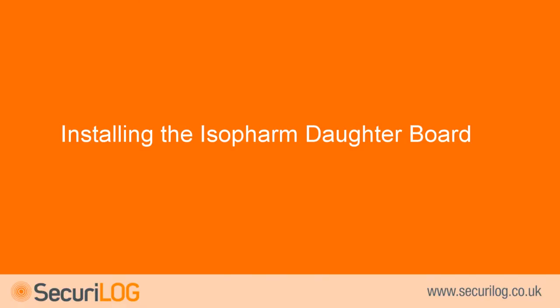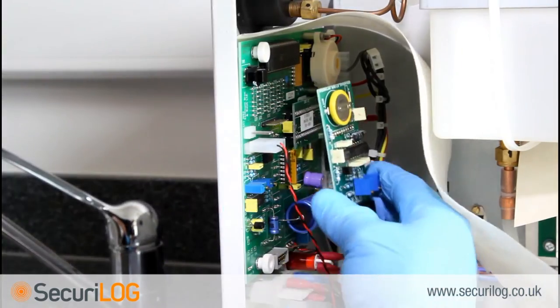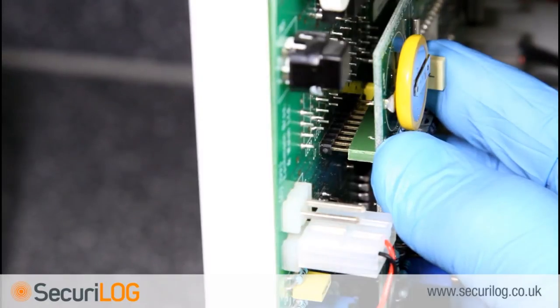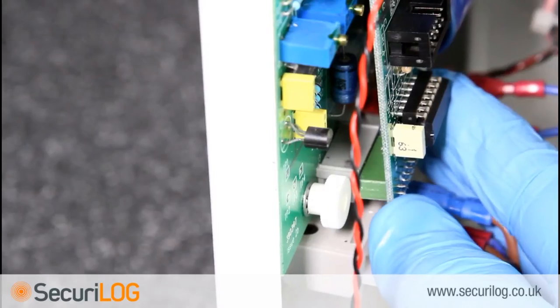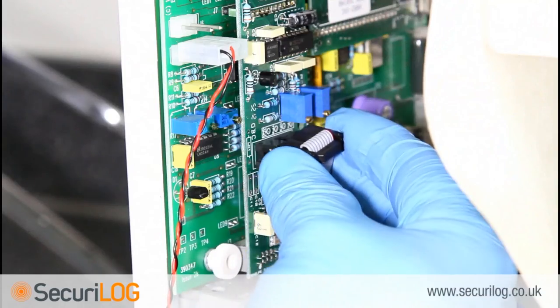Installing the isopharm daughterboard. This part of the installation is only required if the steriliser does not already have a daughterboard installed. Fit the isopharm daughterboard onto the main PCB, taking care to ensure that the 10 pin connector at the top is connected to all 10 pins on the main board, as this is easily misplaced. Once inserted, plug in the Secure log ribbon cable.